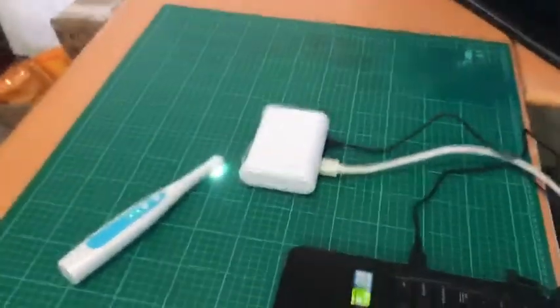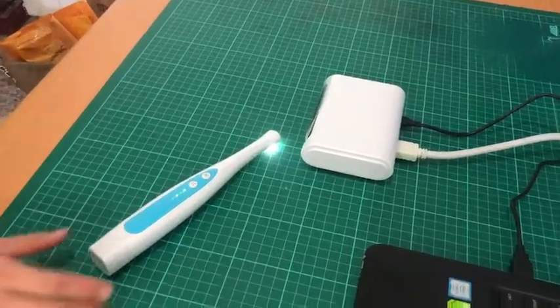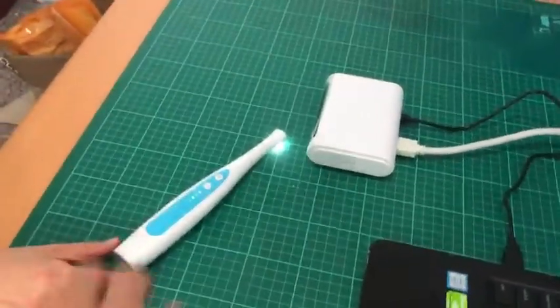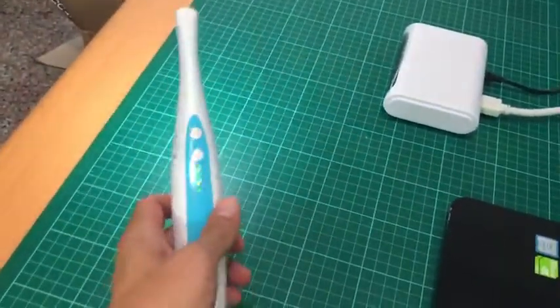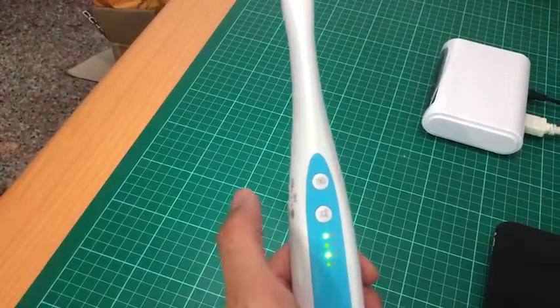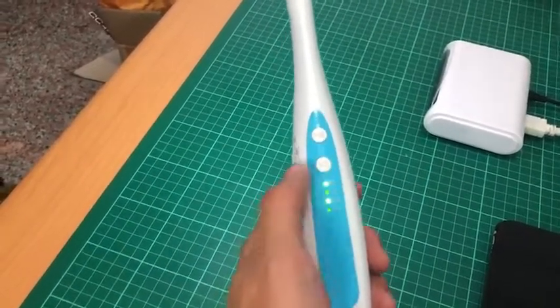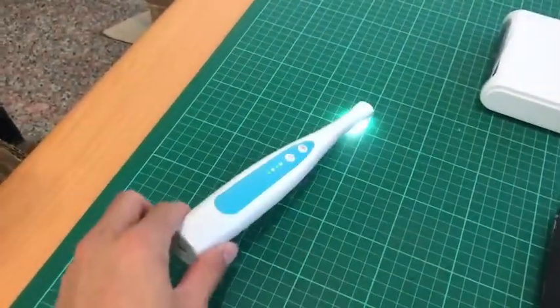Today, let us introduce the new intraoral camera. It's Full HD from Apple Tech. You can see that is the transmitter here. That is the camera side. There is the push button for snapshot and running to check the bigger teeth, and this is the transmitter.